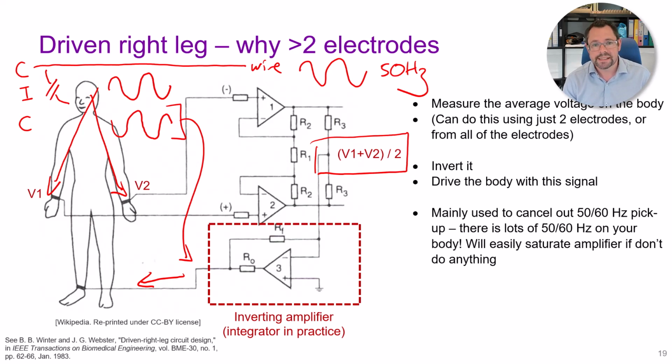But when you set up an EEG, it's very common, if you've not got good quality electrode connections, that all you see is 50 Hertz, or 60 Hertz if you're in the States. And the way to get rid of that is firstly to have a driven right leg, and then secondly to make sure you've got low impedance connections to the scalp, ideally below 5 kilo ohms for a wet passive electrode.